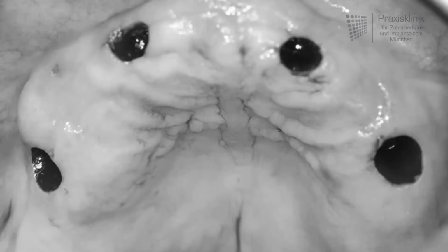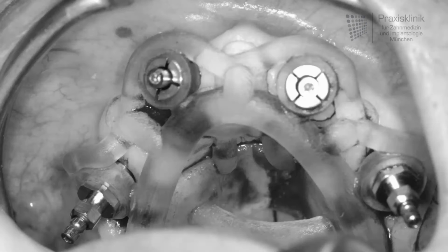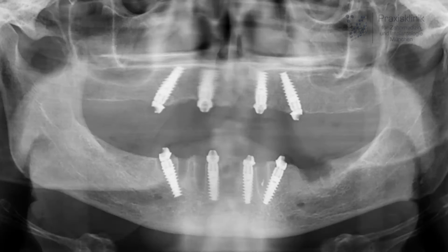For the patient, that means that he has the advantage of being nearly painless and without any kind of swelling immediately post-operative. The next image shows the situation immediately after having placed all 4 implants in the upper jaw through the surgical template. And in the post-operative X-ray image we can see that we achieved a very exact implant position.